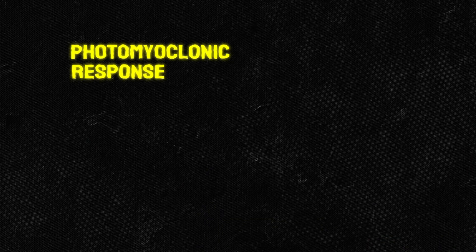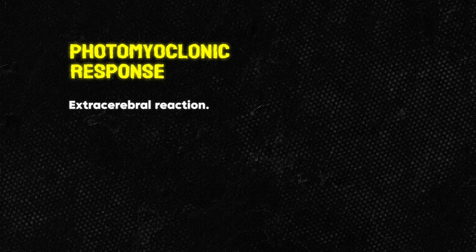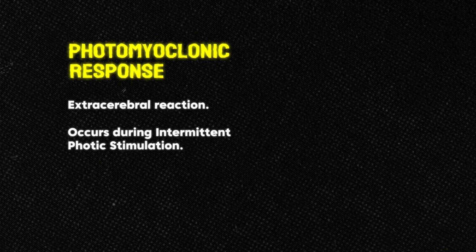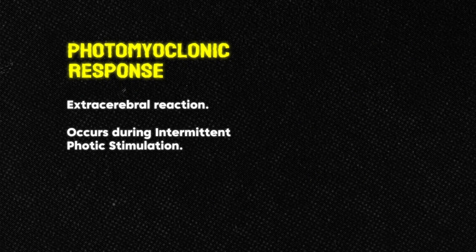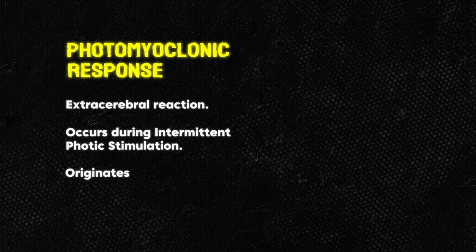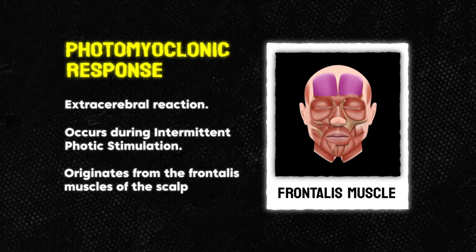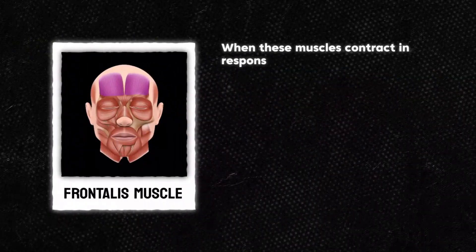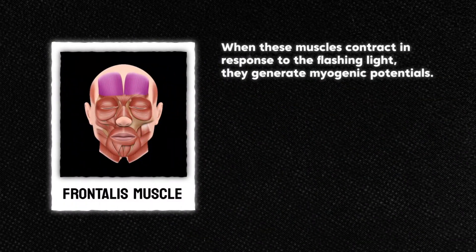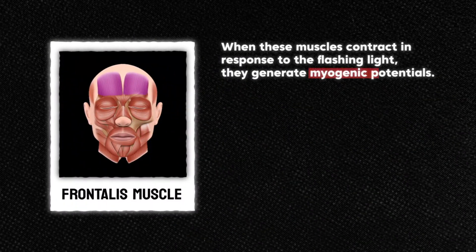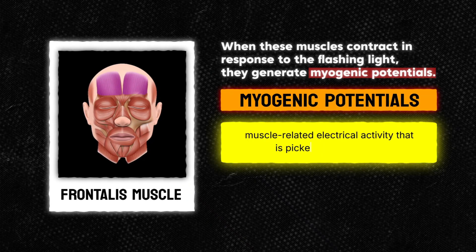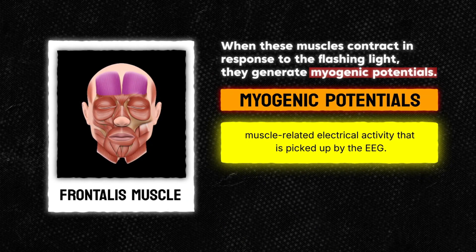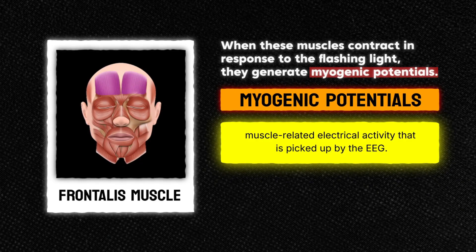A photomyoclonic response is an extracerebral reaction that occurs during intermittent photic stimulation, or IPS for short. This response originates from the frontalis muscles of the scalp. When these muscles contract in response to the flashing light, they generate myoclonic potentials — essentially muscle-related electrical activity that is picked up by the EEG. These myogenic potentials can range from a single motor unit potential to a sustained series of spikes.